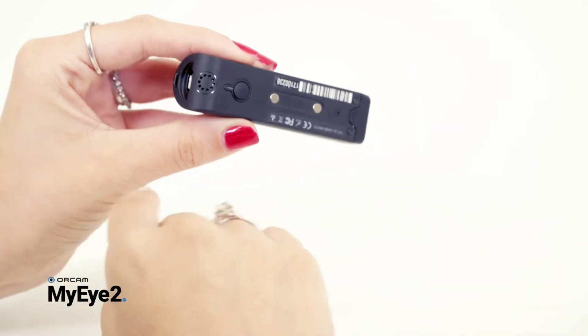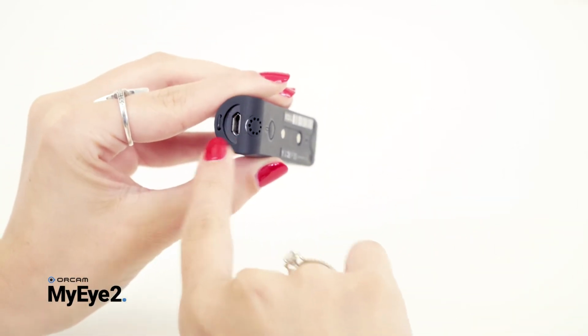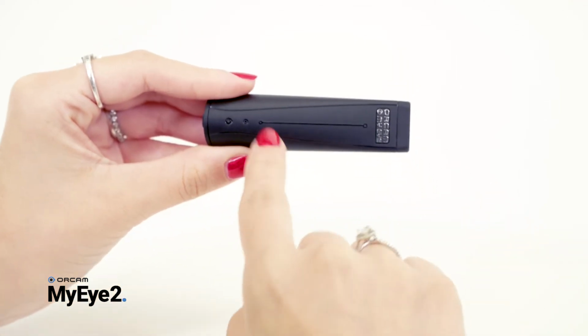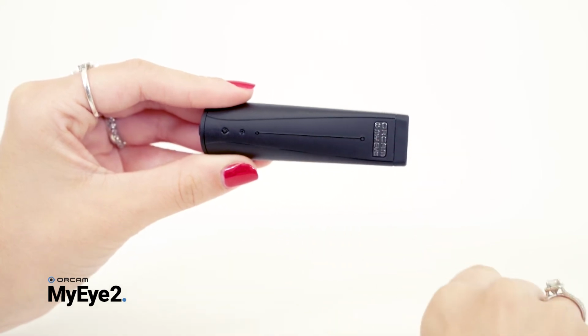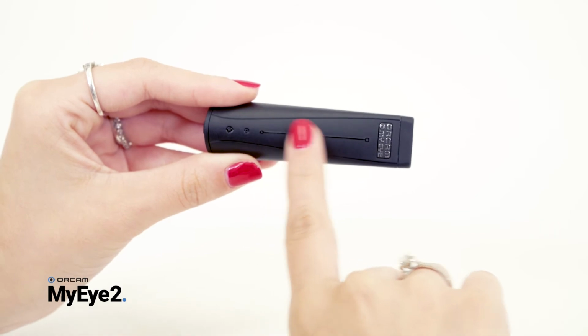Just behind the power button is the speaker, followed by the USB inlet, which is on the rounded end of the device. Now turn your device around and you will notice a long touch bar. This is where you activate your device, either by touching the bar or by swiping it.